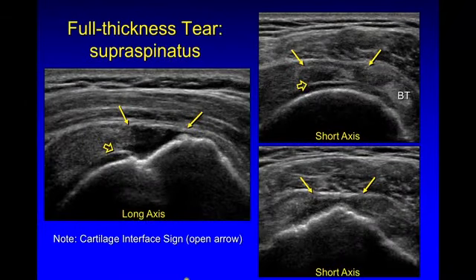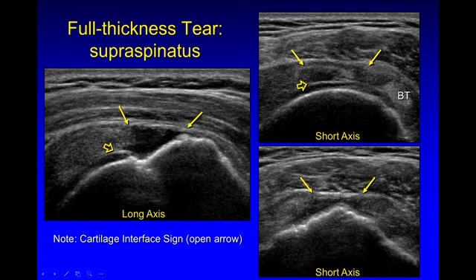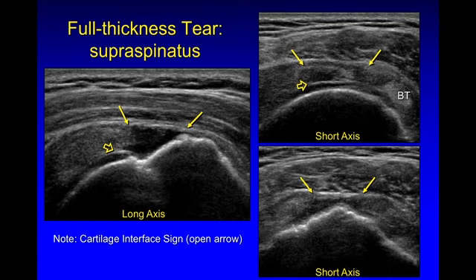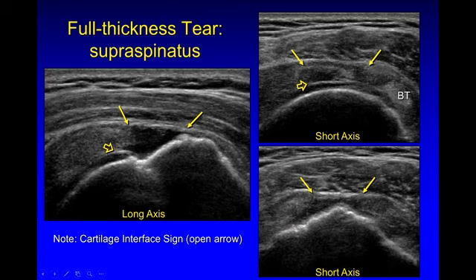Here's an example of a full thickness tear. This one is a little bit easier because the defect is filled with anechoic fluid, which clearly outlines the end of the tendon stump torn from the greater tuberosity. Also note another indirect sign of a rotator cuff tear by ultrasound: the cartilage interface sign. If you have fluid laying on top of the normal hyaline cartilage, the interface between that cartilage and fluid will be even brighter than normal, indicating extension to the articular surface. Here in short axis we can see the full width of the tear, and looking more distal over the greater tuberosity facets, the width of the rotator cuff tear.